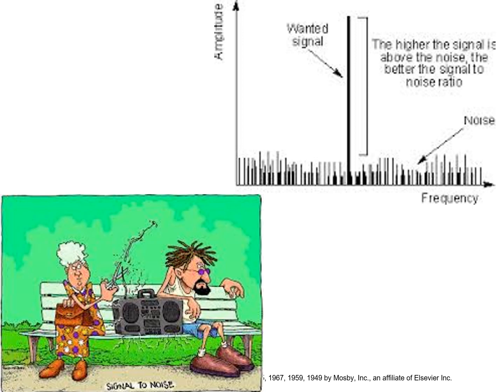All right, so signal to noise ratio. Now, most people don't listen to music stations anymore, but we have a classic rock station here in Nashville. It's called the Rocket 105.9. And a lot of people like to drive out to the UT football game out in Knoxville. Now, my question for you is, can you listen to the Rocket 105.9? Can you listen to the Eagles and 20 other songs from the 70s all the way to Knoxville? And the answer is no. And why do you think that is? Well, it's signal to noise ratio.